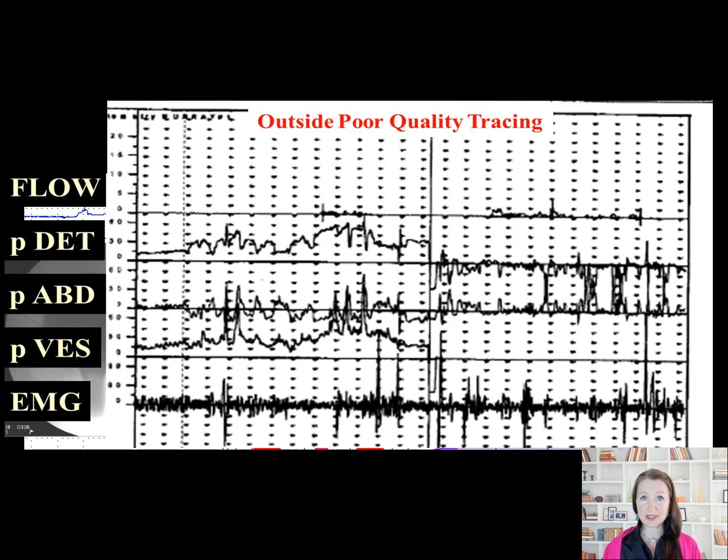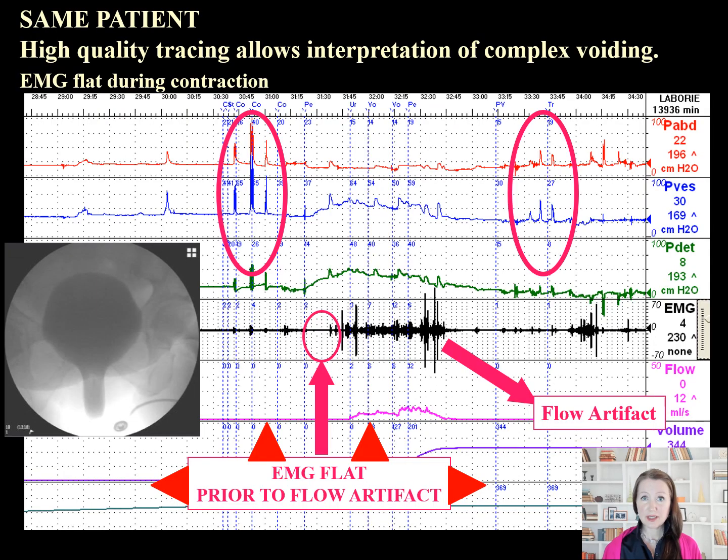A good tracing allows competent interpretation. This patient was previously diagnosed with detrusor sphincter dyssynergia and offered a suprapubic catheter. This study in the patient who has a cystocele has responsive abdominal and bladder catheters, allowing proper interpretation of her detrusor pressure. The EMG shows a good response to cough. During the initiation of the contraction, the EMG is in fact flat and does not change until the flow begins, which represents artifact from the flow passing over the patches. She does not have detrusor sphincter dyssynergia — she needs repair of her prolapse.